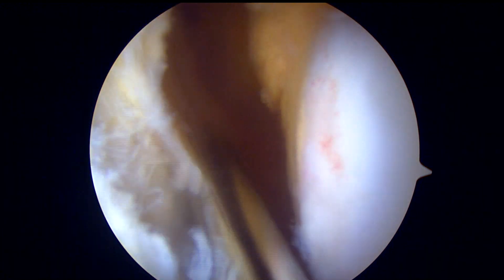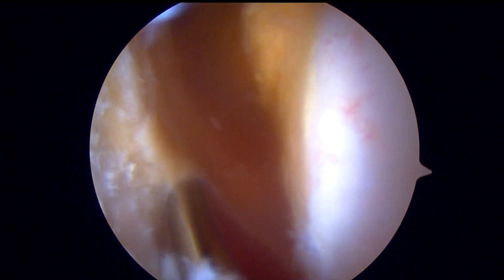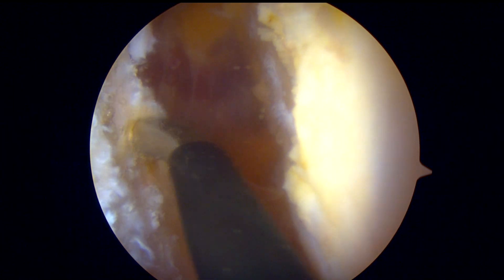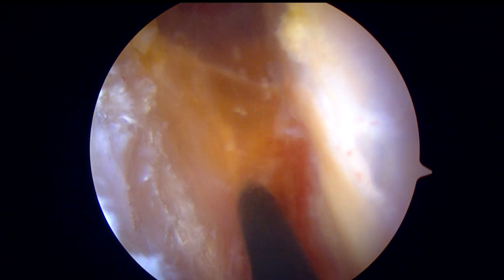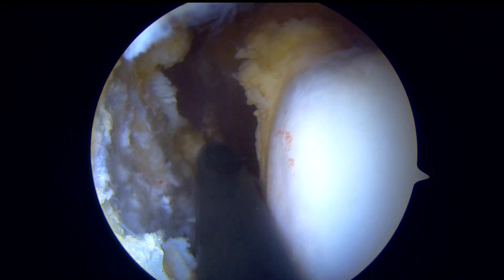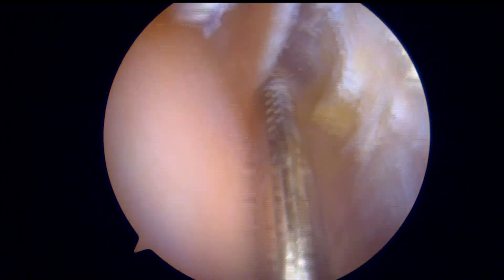We then address the medial and lateral gutters. Here in the lateral gutter, the arthroscopic shaver is used to remove the synovial lining. The tissue remaining on the inner and outer aspects of the knee is the retinacular tissue, visible in this arthroscopic video. The ArthroCare wand is again used to remove the synovial tissue and ablate any bleeding vessels. Once completed in the lateral gutter, we advance to the medial gutter and perform the same arthroscopic synovectomy.